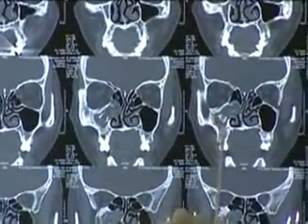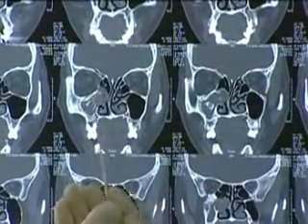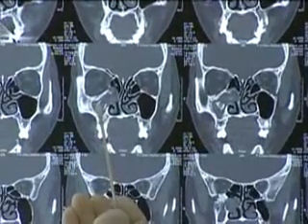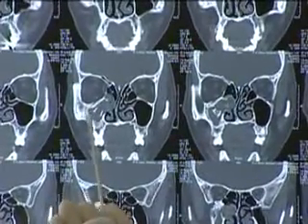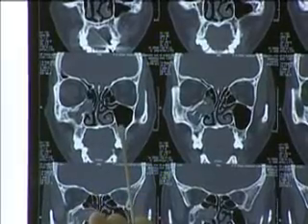So this is the significant thickening of the floor of the orbit. You see the floor? Yeah, here. A lot of new bone formation. I think the calcification that you just talked about is actually the fungal content, rather than calcification along the wall of the maxillary sinus. So actually it's not a very big sinus, as you can see here, as you compare with the other side.